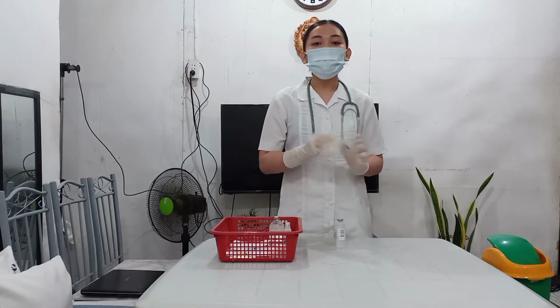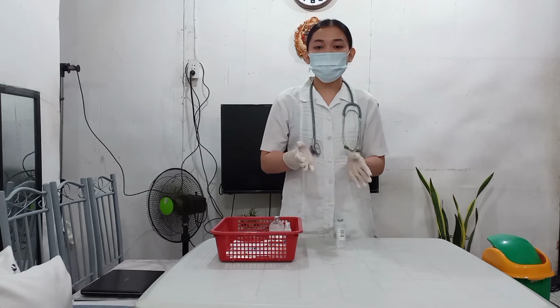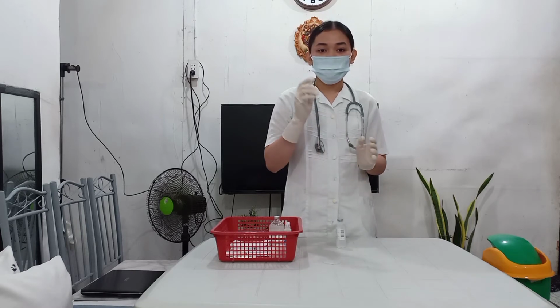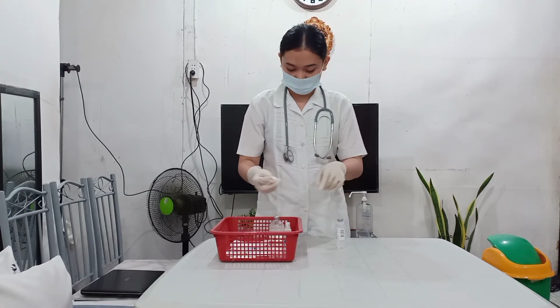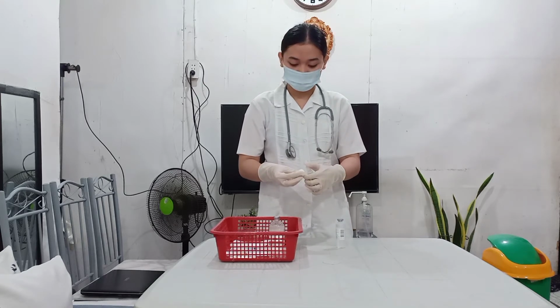Now, we attach the filter needle to the syringe. A filter needle will reduce the chance of glass being introduced into a medication. But before that, I am going to clean this rubber of the ampule just to make sure that it is free from contamination.